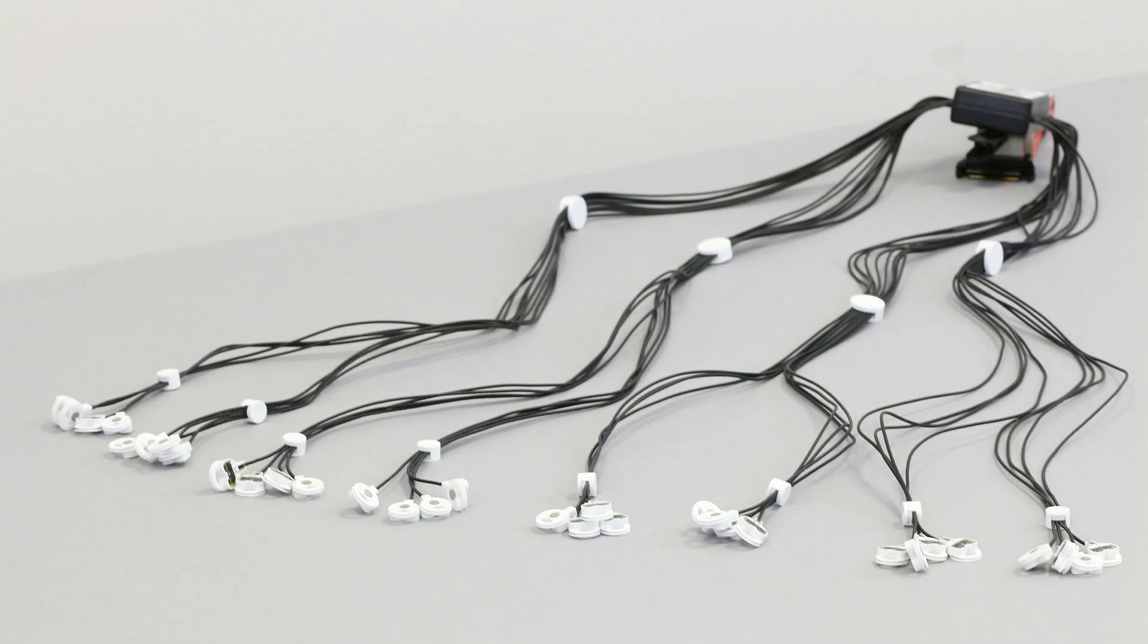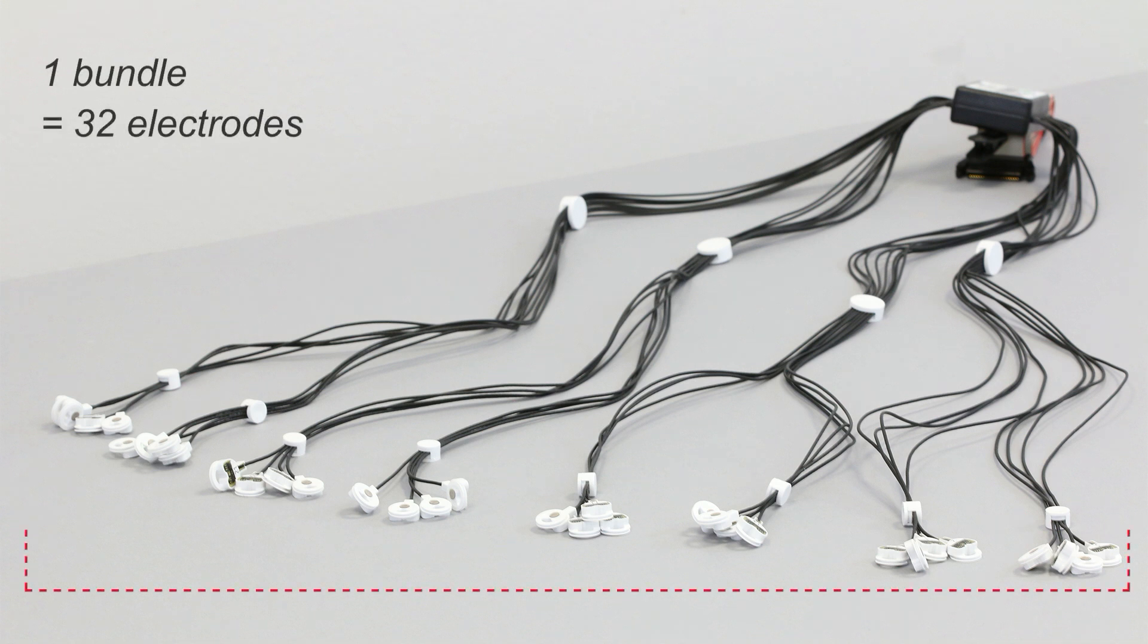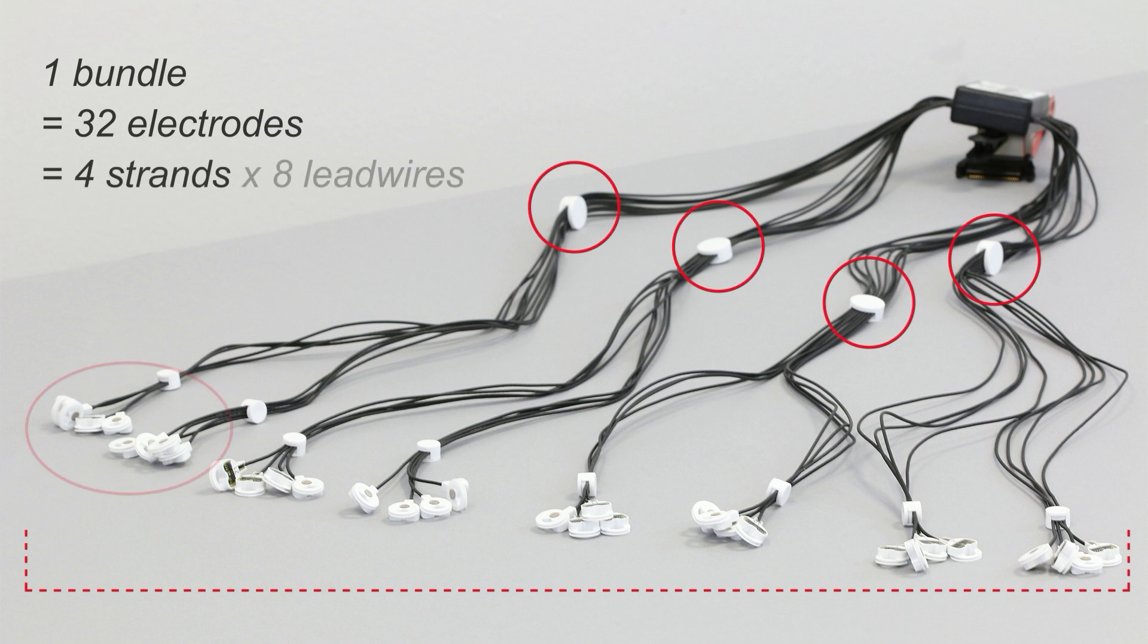ActiCap electrode systems have a flexible design consisting of stand-alone bundles of 32 electrodes, arranged in 4 strands of 8 lead wires.